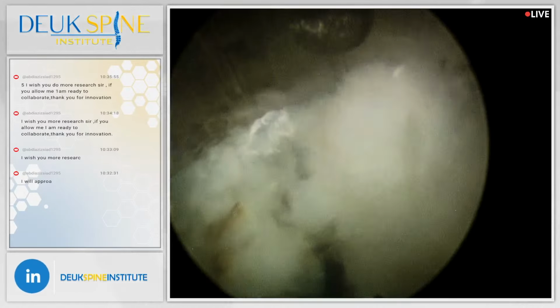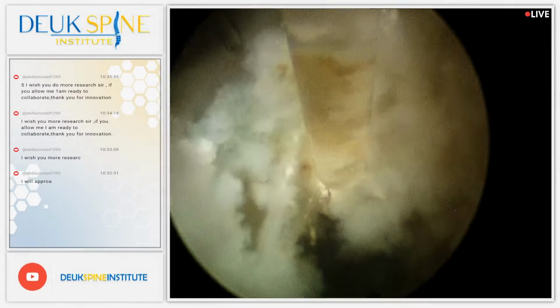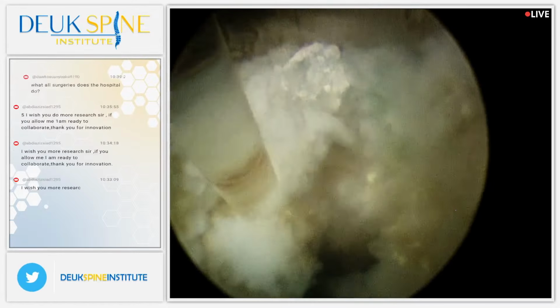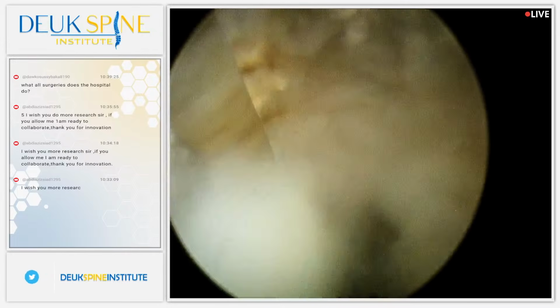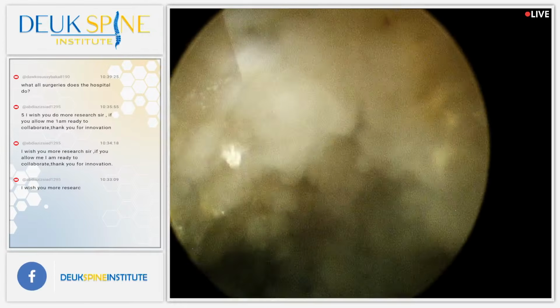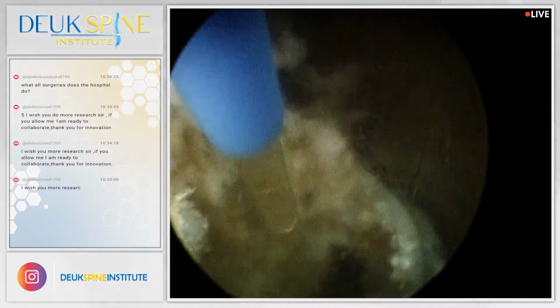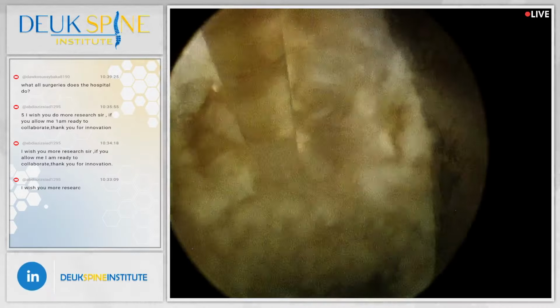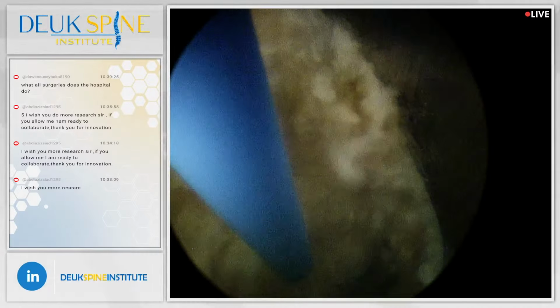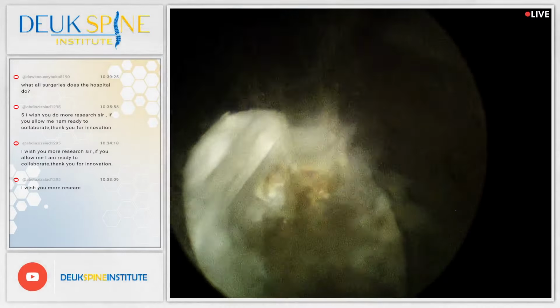We are in the herniation right now. This is herniation here. You can see the gold color is calcium. When the laser energy interacts with the calcium from the chronic inflammation that's located inside this annular tear and herniation, it turns a gold color. You guys see that? So we call this calcium dystrophic calcification. That is the pathological term for it. It is found in abnormal chronic inflamed tissues. It's been well established by pathologists for many hundreds of years, using microscopes to find it.